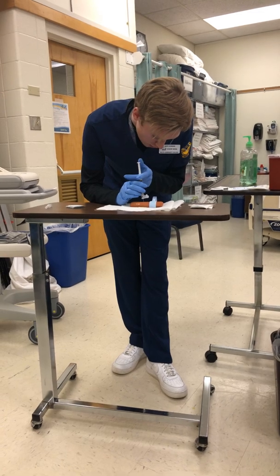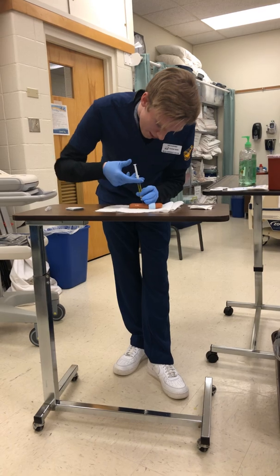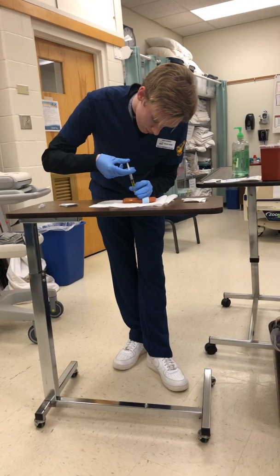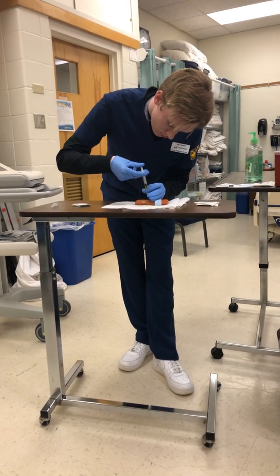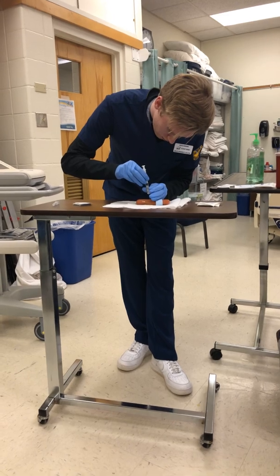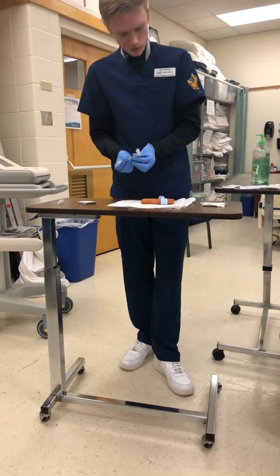And then doing this still, you would grab here, and then slowly administer the medication. And then pull up. All done.